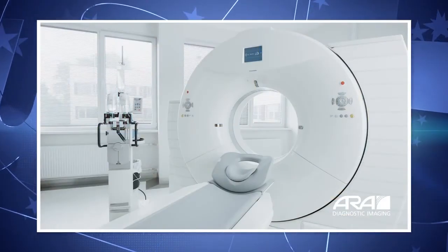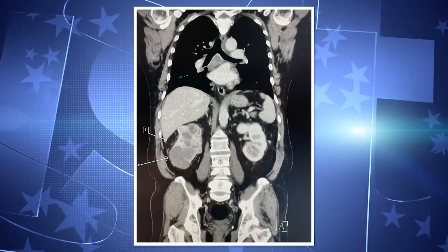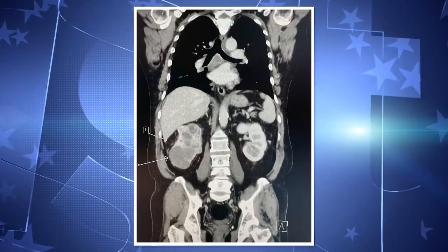It was great to see those too. As a radiologist, what is it that you like most about CT and how does it benefit patients in turn? Yeah, it's just, again, I think the agility of it, or the ability that it can just be such a workhorse. We can use it in emergencies quickly, preoperatively, like we talked about with this wrist, and then just its overall cost makes it much more available.